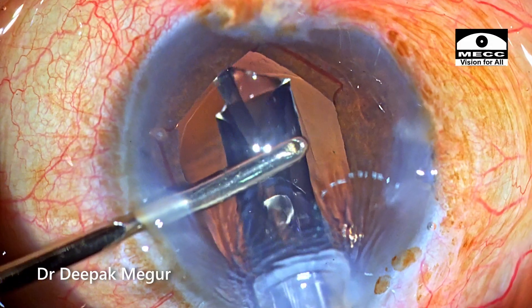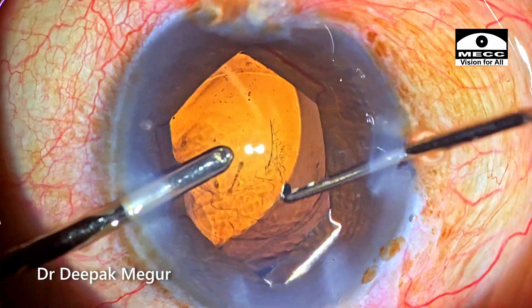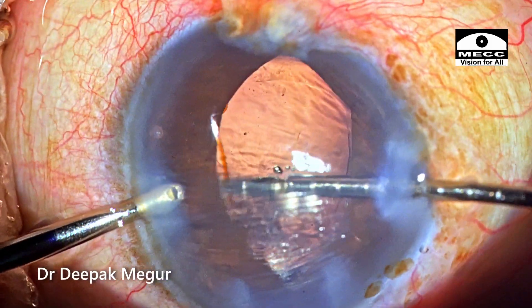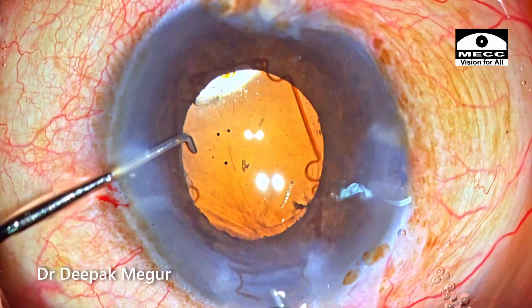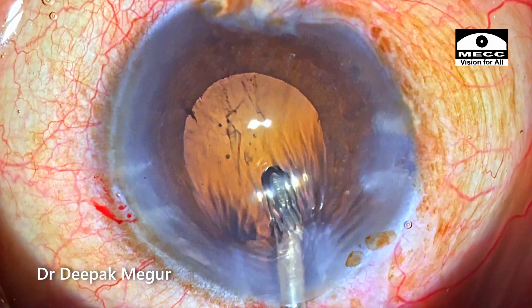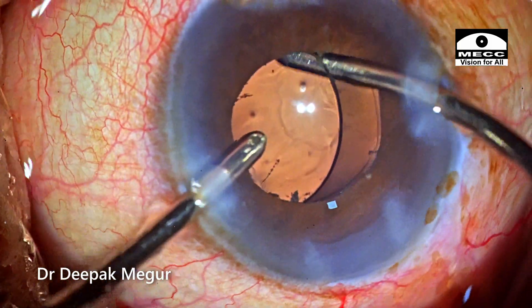A single-piece hydrophobic intraocular lens is placed. The proximal haptic is gently maneuvered into the bag. Now is the time to remove the BX ring — first it's disengaged from the pupil and then pulled out quite easily. The lens is gently tipped up and using the irrigation handpiece, the OVD behind the lens is gently irrigated out.